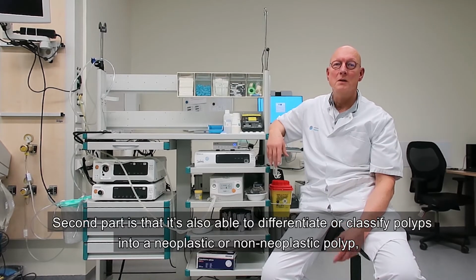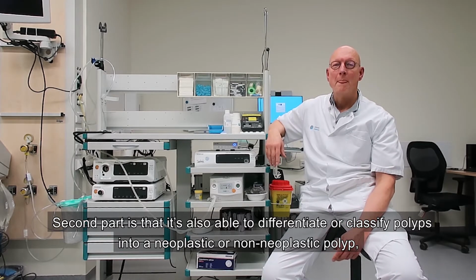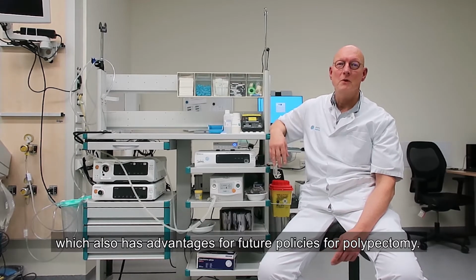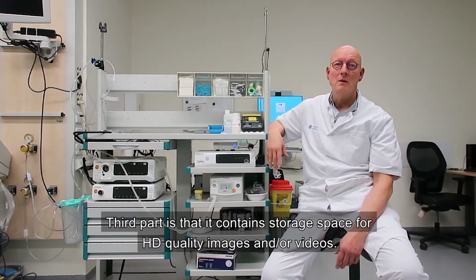The second part is that it's also able to differentiate or classify polyps into neoplastic or non-neoplastic polyps, which also has advantages for future policies for polypectomy. The third part is that it contains storage space for HD quality images and/or videos.